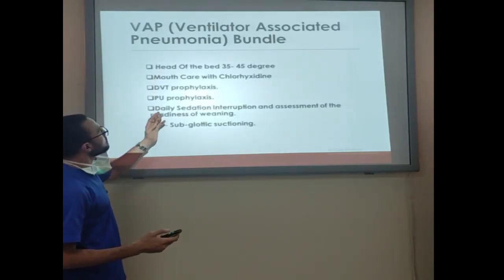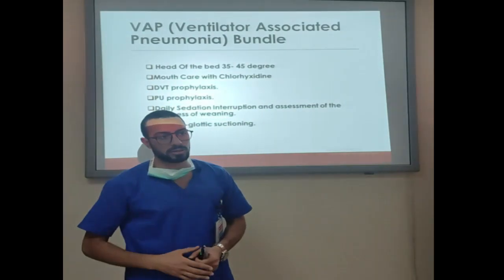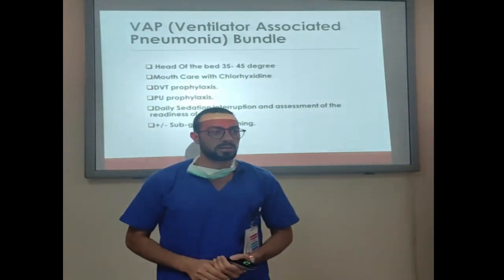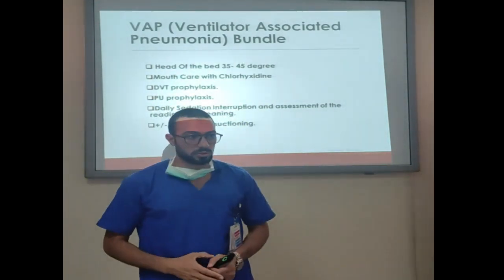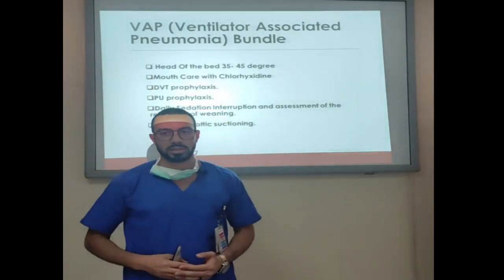So also, to prevent the tracheoesophageal fistula, if we have prolonged intubation, the doctor for sure will think about tracheostomy. Tracheostomy maybe after 14 days. We will not leave the patient on an endotracheal tube for more than 14 days.